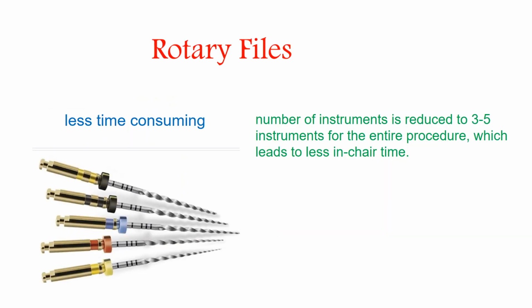Then we are coming on to the niti rotary files. So these files are very less time consuming and there is a very less amount of effort needed while doing the root canal treatment if you're using these files. And also the number of instruments is reduced to almost 3 to 5 instruments for the entire root canal procedure, which takes less chairside time. So these are the better advantages of the niti rotary files.